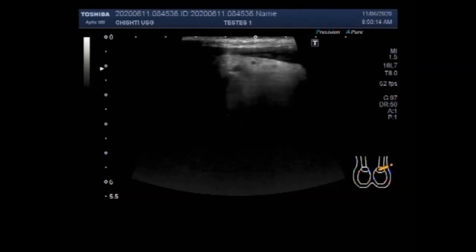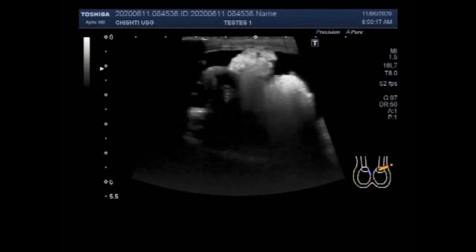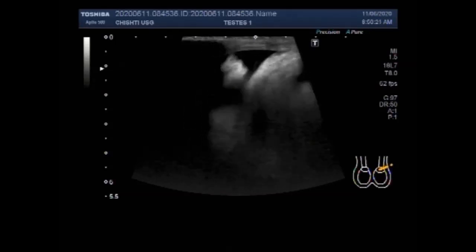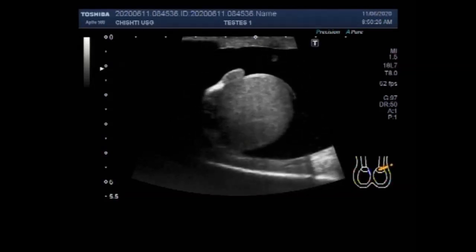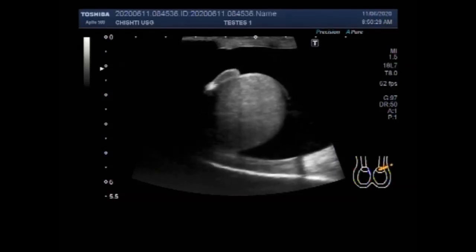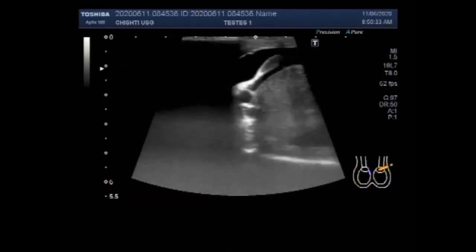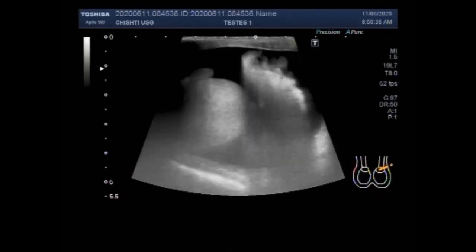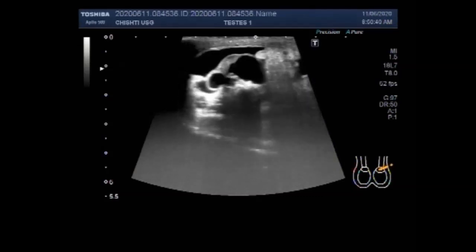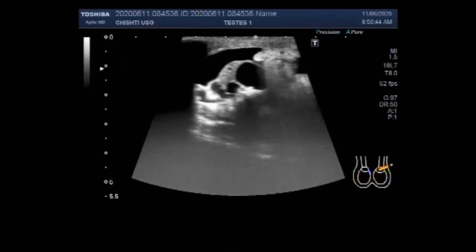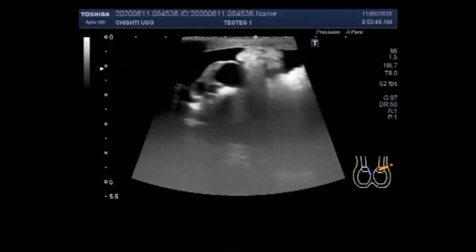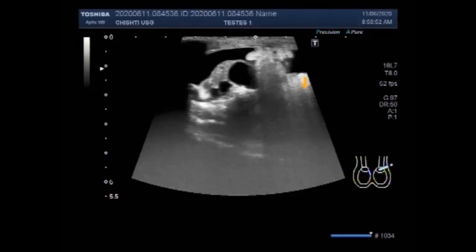Hydrocele can occur in one or both sides of the scrotum and usually grows slowly. A communicating hydrocele can form at any age but is more common in infants and children — this kind gets bigger and smaller. The scrotum is the sac of skin that holds the testicles once they descend, allowing fluid to move from the abdomen into the scrotum. Hydrocele can also be caused by inflammation or injury, such as epididymitis. Now you can see an epididymal cyst in the head of the epididymis.